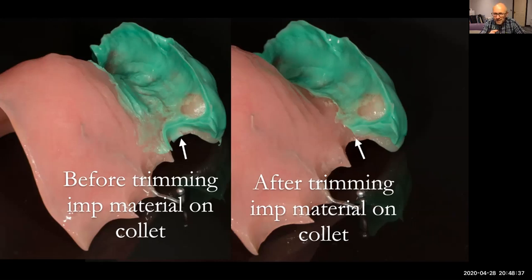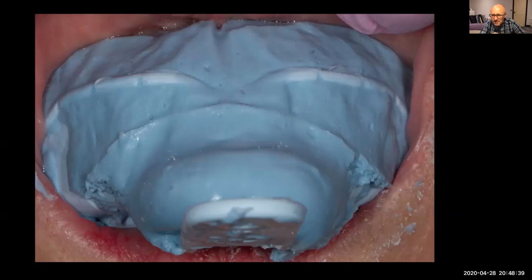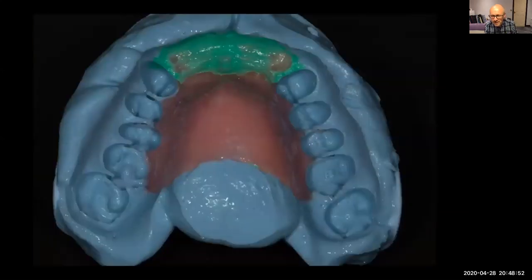I then put this back in the mouth like this. And then I seat the denture back in the mouth. And then I fill a stock tray with alginate and push it over. Let that set. And I pick up the denture. And this goes through to Rowan now.